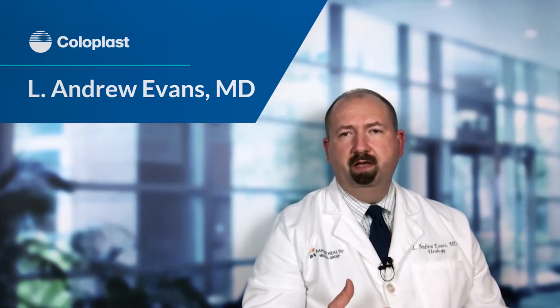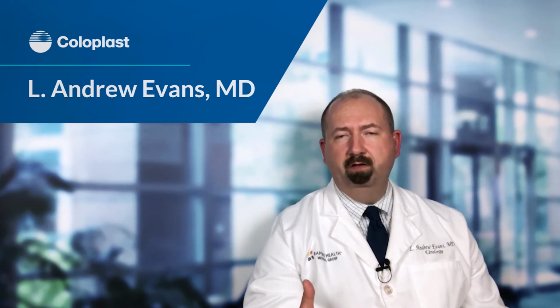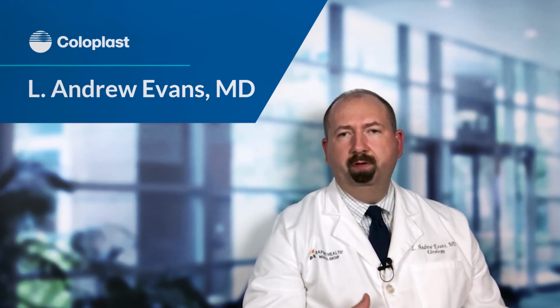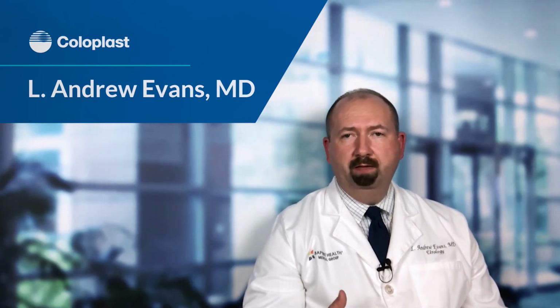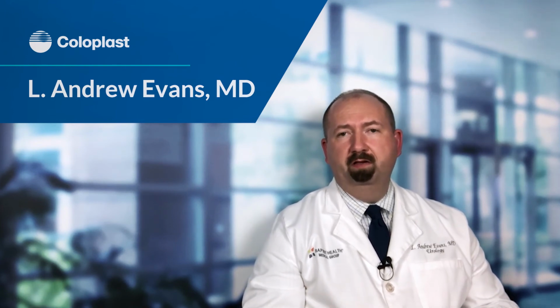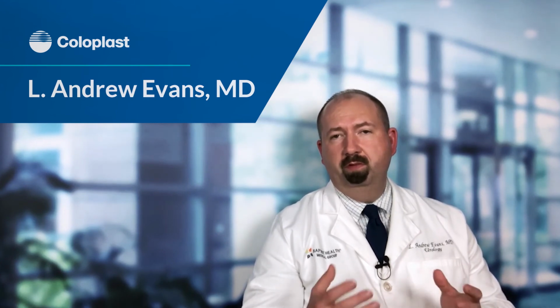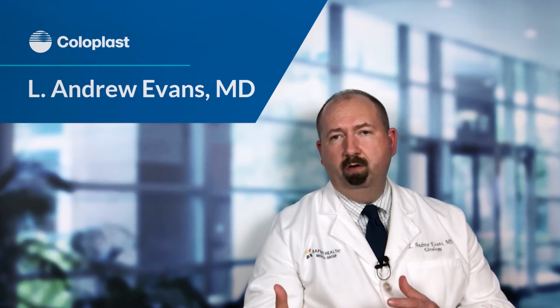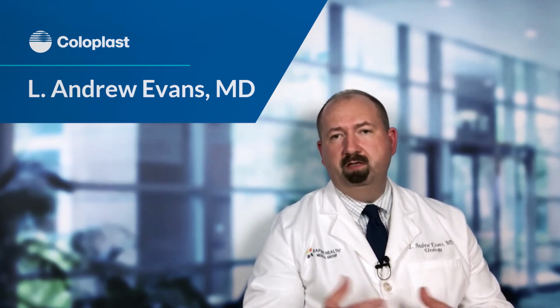The data suggests that slings can achieve greater than an 85% dryness rate if patients are appropriately selected. I would say that patients that don't do well after a male sling generally should have gotten a sphincter to begin with because their leakage was so heavy from the start. I will say that having a sling placed certainly does not prevent you from having further treatment down the road. In other words, you can always have a sphincter placed to achieve dryness if the male sling does not work.